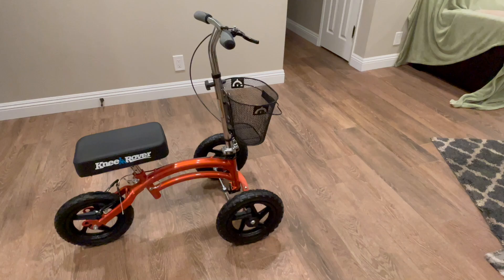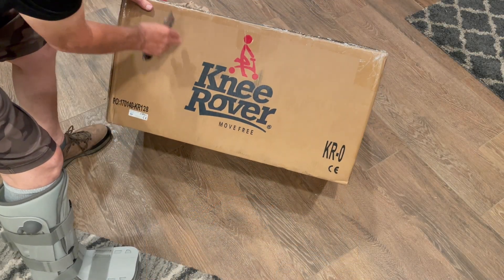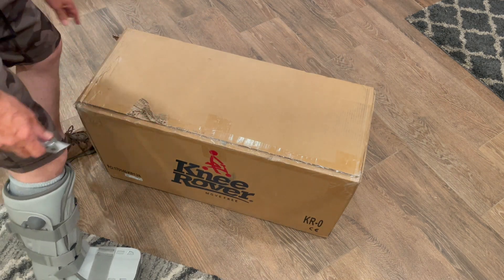Here it is, my new three-wheeled scooter, and hopefully it's going to help me get around with this broken ankle. It came in this box, shipped all the way from the East Coast, and I'm going to bust it open now and see what we have inside.